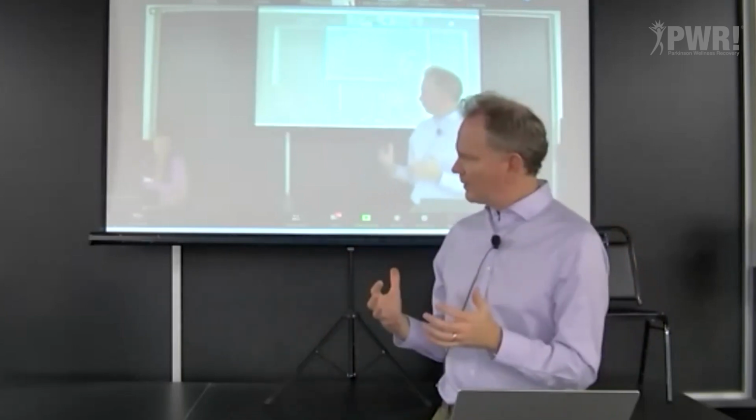So there is this balancing of getting potential side effects by stimulating very big areas. I wouldn't really say that's a risk because we have control over that, but that's something to think about. Could be.